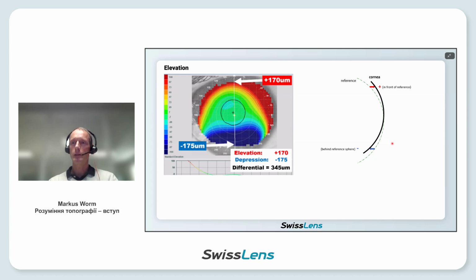On the right side, you can see this image showing a thin green line representing the reference sphere and a fat line in black for the cornea. Every part of the eye that is in front of this reference sphere has a positive, here red, value. The one behind the sphere, a negative, blue value.